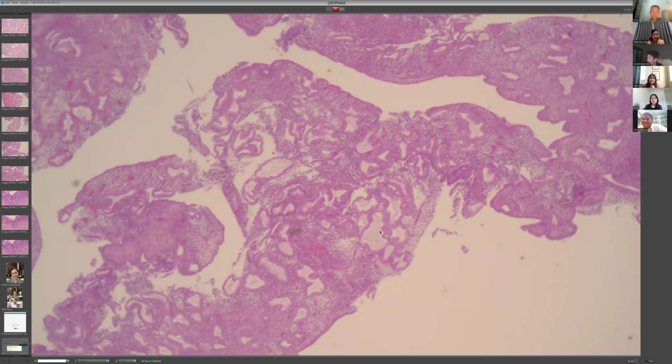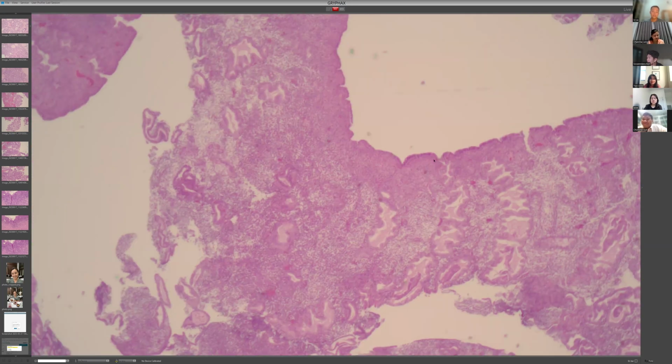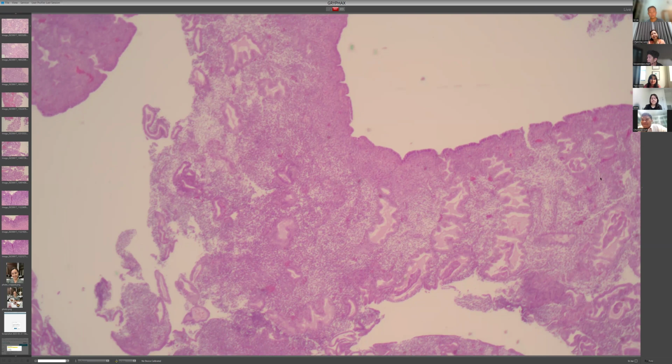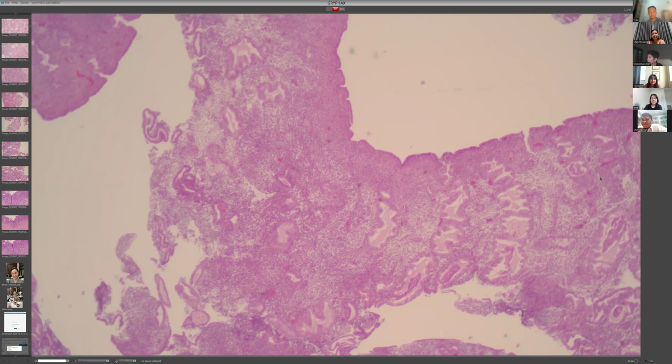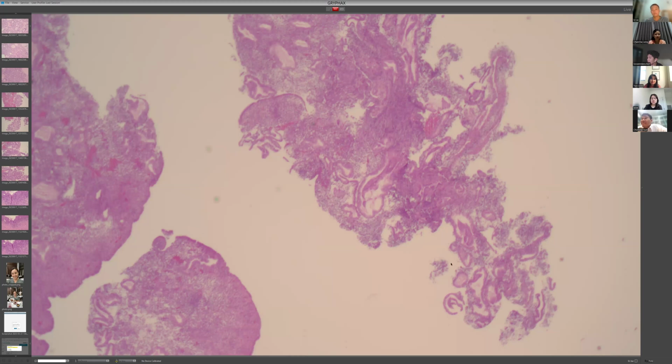So this is a secretory phase of your endometrium. You can see the glands going from the basal layer all the way to the top of the surface. The stroma has some areas with white spaces in between and the nuclei are far apart, so it's kind of edematous. And in some areas, as Dr. Minnie was saying, there's artifactual telescoping in fragmented areas.